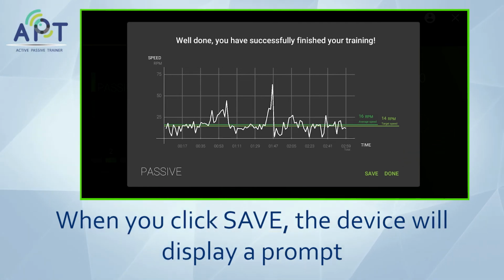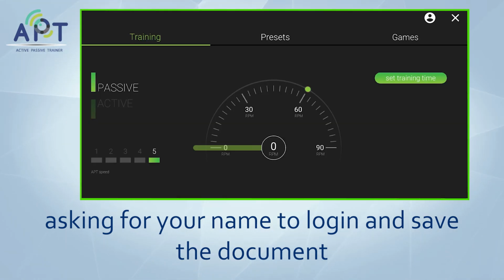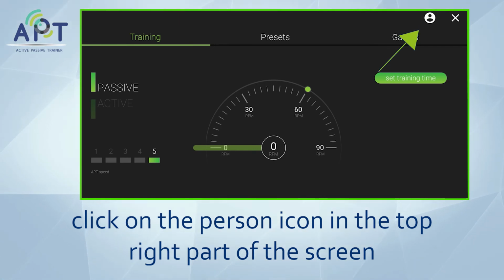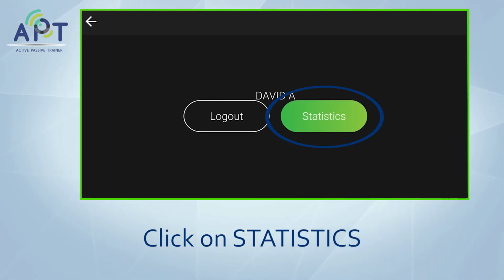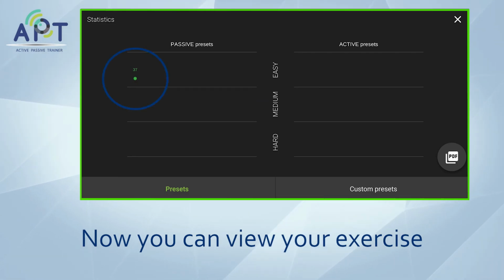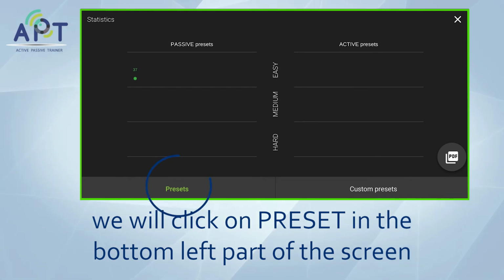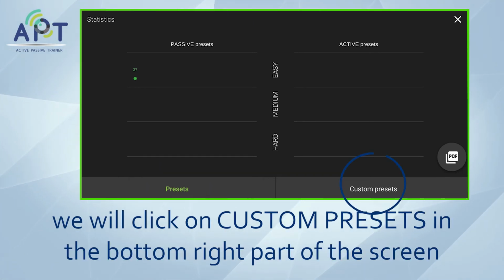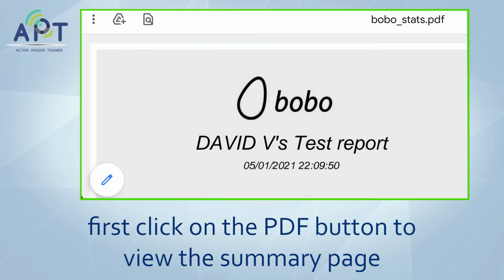When you click Save, the device will display a prompt asking for your name to log in and save the document. To view the exercise summary and send it to your caregiver, click on the person icon in the top right part of the screen. Click on Statistics. Now you can view your exercise. If a device preset adjustment was made, we will click on Preset in the bottom left part of the screen. If a custom preset adjustment was made, we will click on Custom Presets in the bottom right part of the screen.